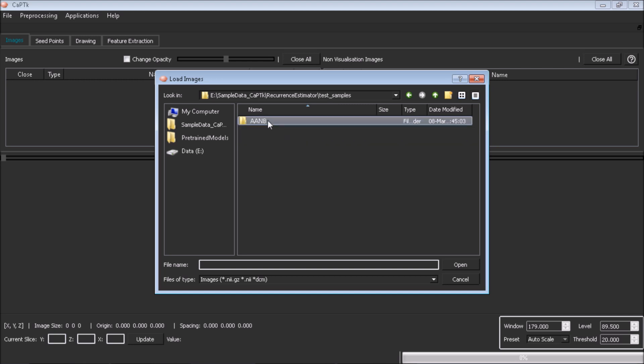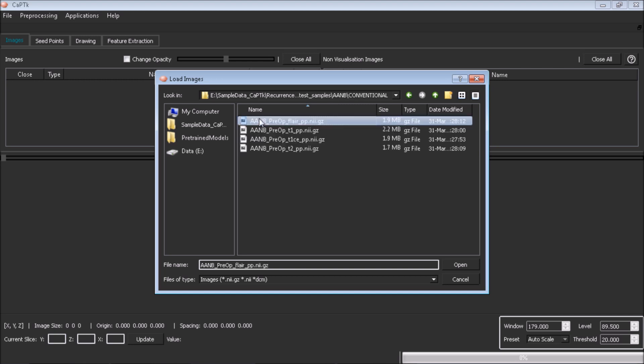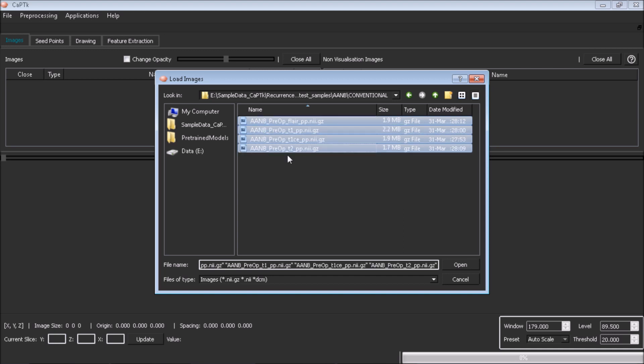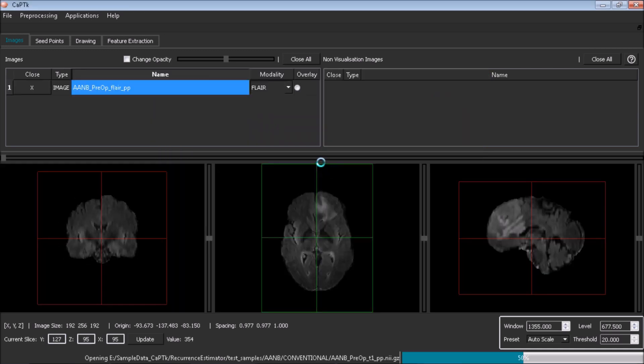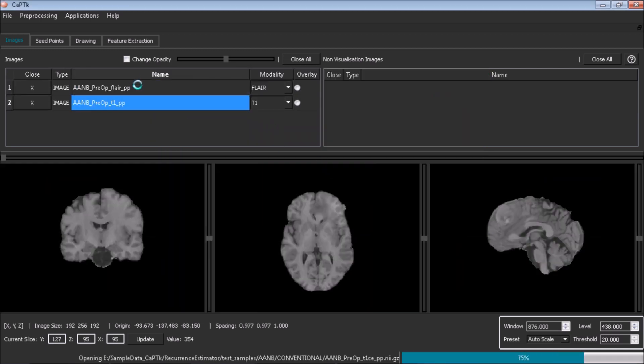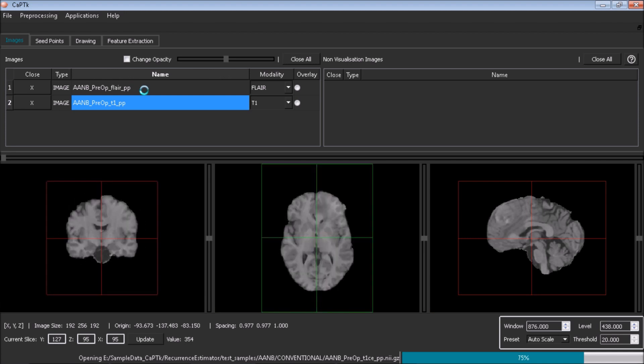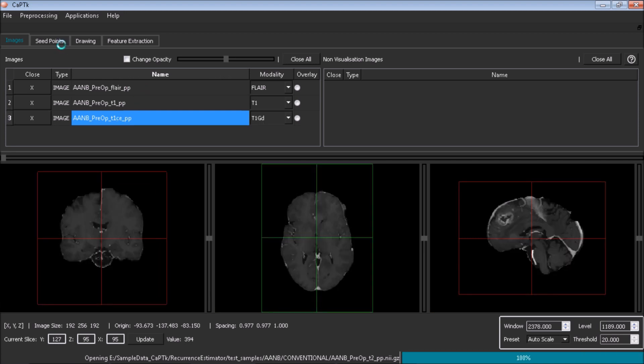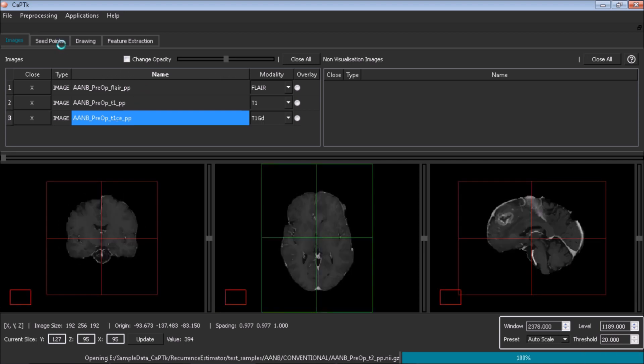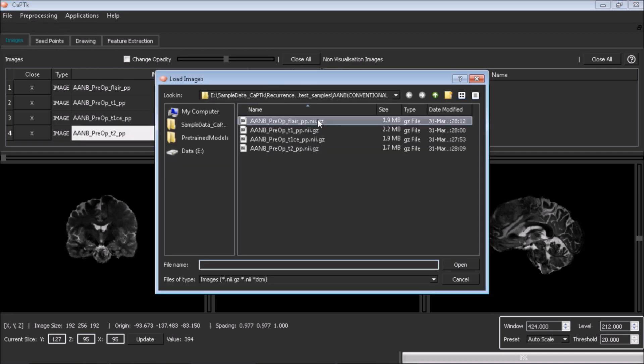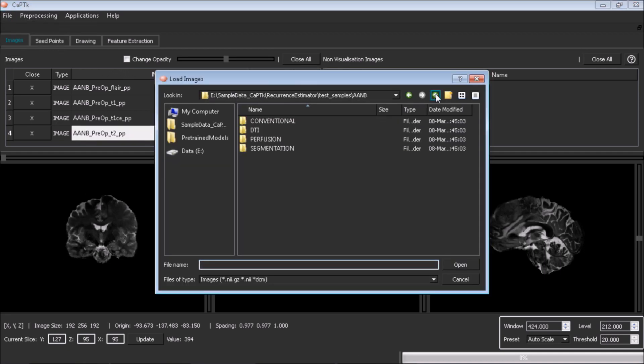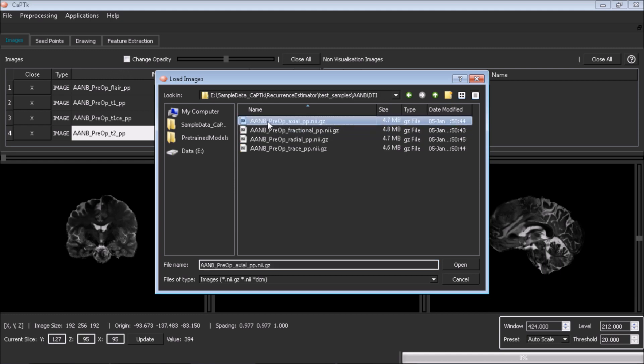Load the required modalities: T1, T1 post-contrast, T2, T2 FLAIR, DSC MRI, DTI axial, DTI radial, DTI trace, DTI fractional anisotropy, and ensure they have been correctly identified by CaPTK using the modality selector combo box.